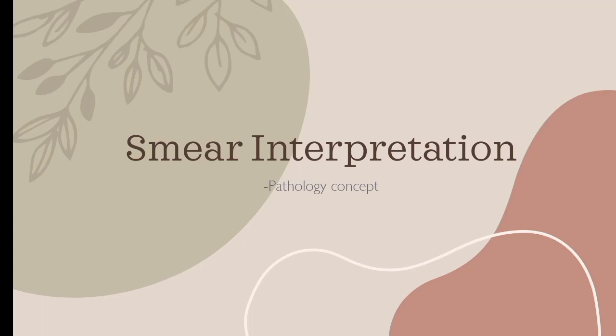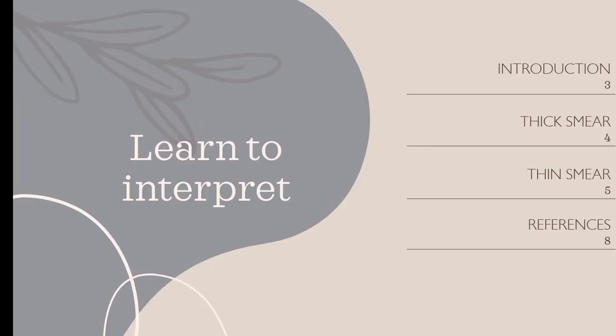Hello everyone, welcome. Today's topic is smear interpretation. Peripheral blood smear is a laboratory test that involves the cytologic analysis of peripheral blood cells. In this topic, we will learn the introduction of the smear, thick smear interpretation, thin smear interpretation, and summary.